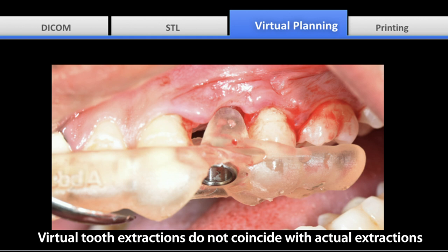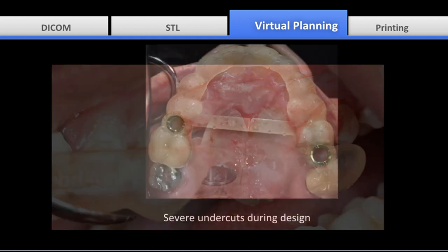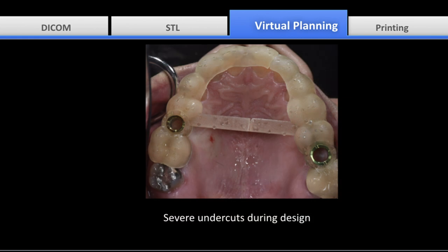And this is an example of lack of fitting of a surgical guide, which can result in deviation of implant insertion. Another potential source of error is designing the guide to engage heavy undercuts on both sides of the arch. For this guide to fit, we had to divide it into two halves.